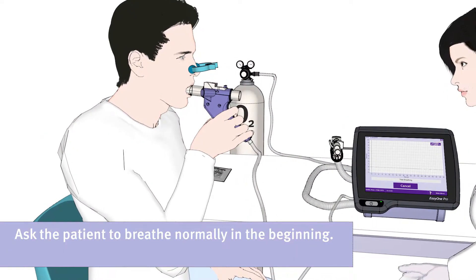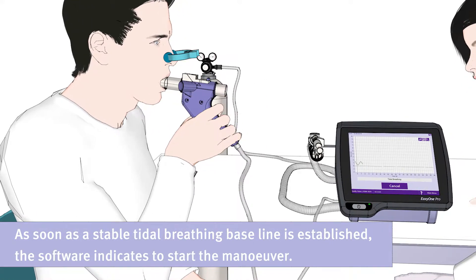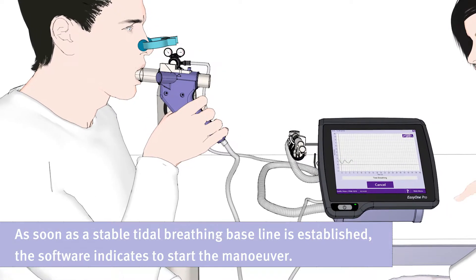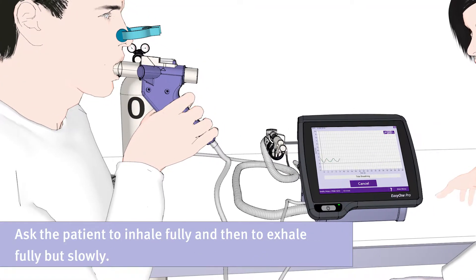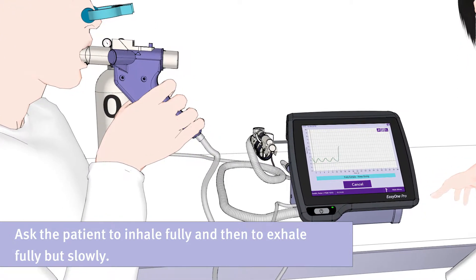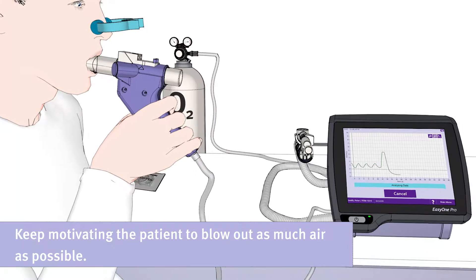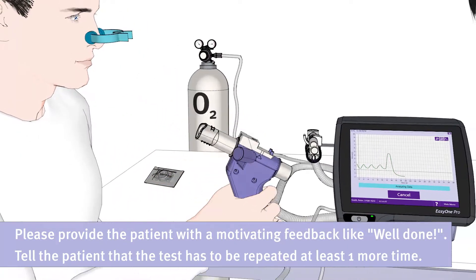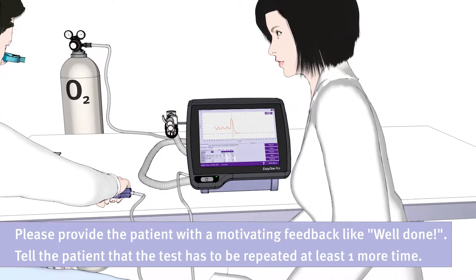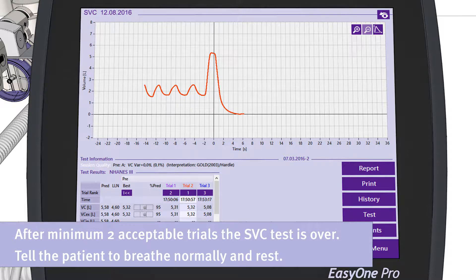The patient should breathe normally in the beginning. As soon as a stable tidal breathing baseline is established, the software indicates to start the maneuver. Ask the patient to inhale fully, and then to exhale fully but slowly. Keep motivating the patient to blow out as much air as possible. Please provide the patient with motivating feedback like 'well done', and tell him that the test has to be repeated at least one more time. After a minimum of two acceptable trials, the SVC test is over and the patient can be told to breathe normally and rest.